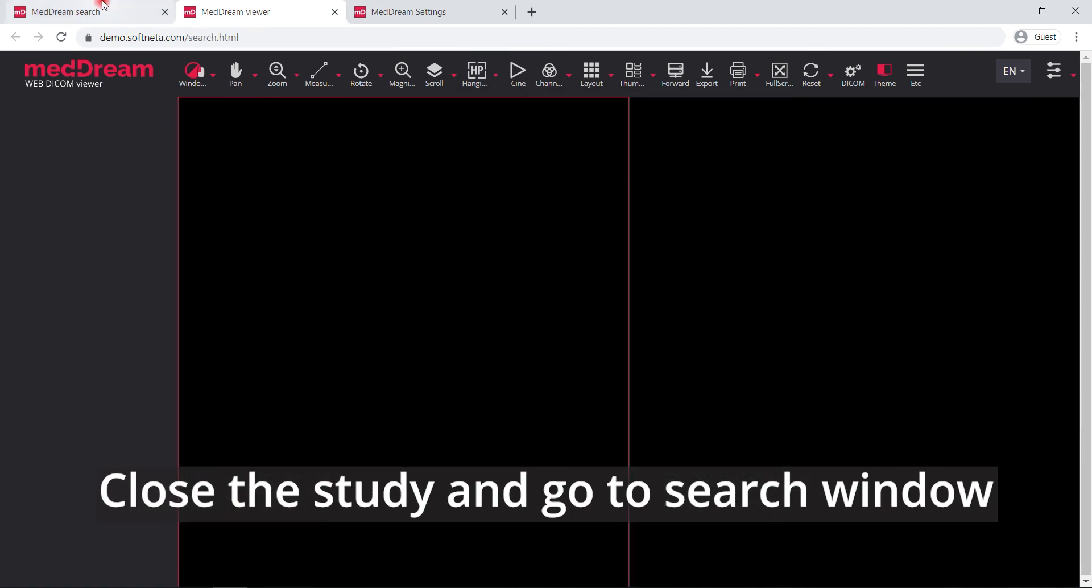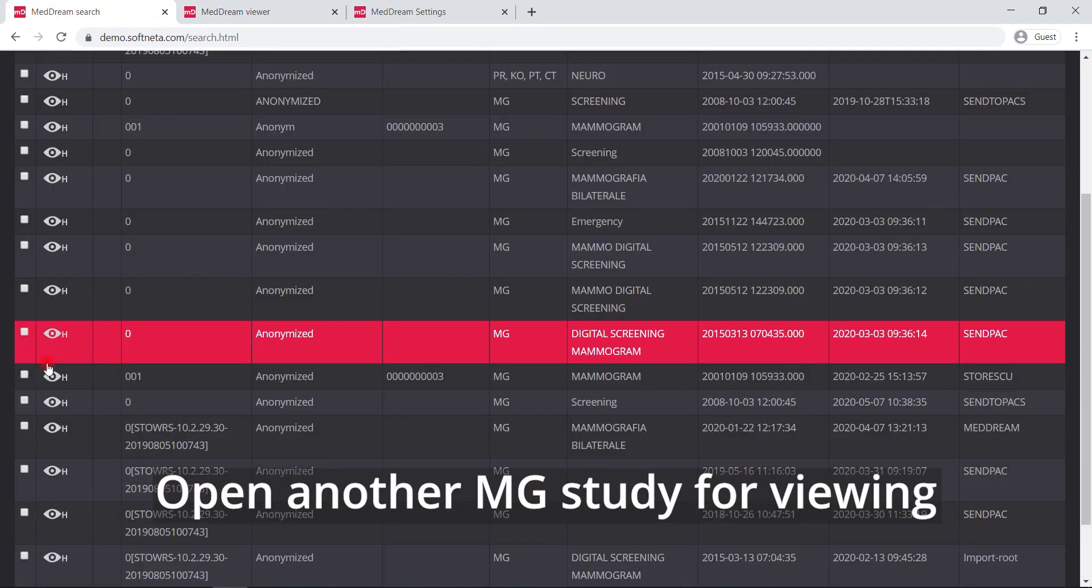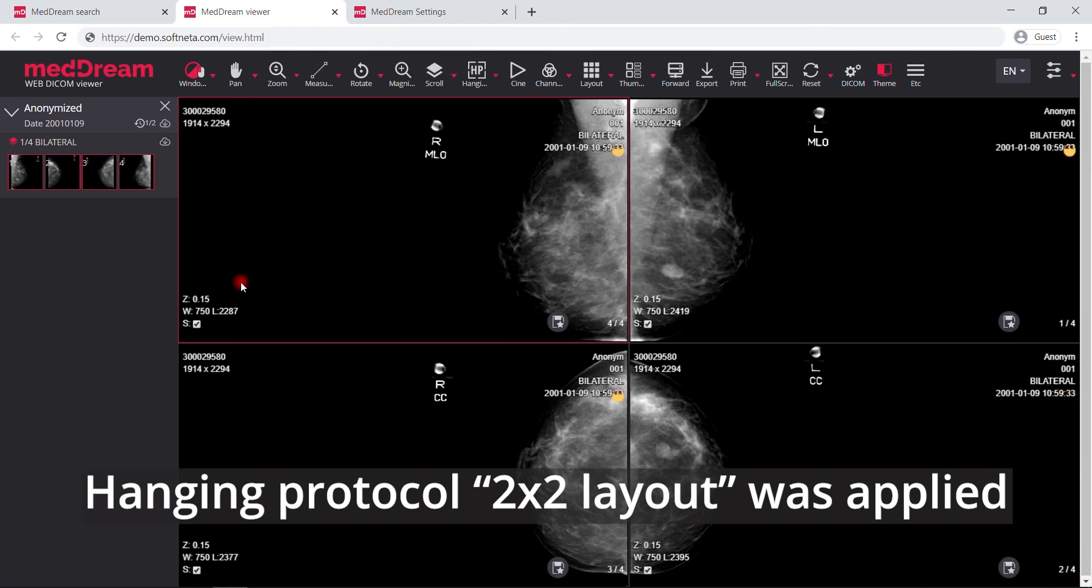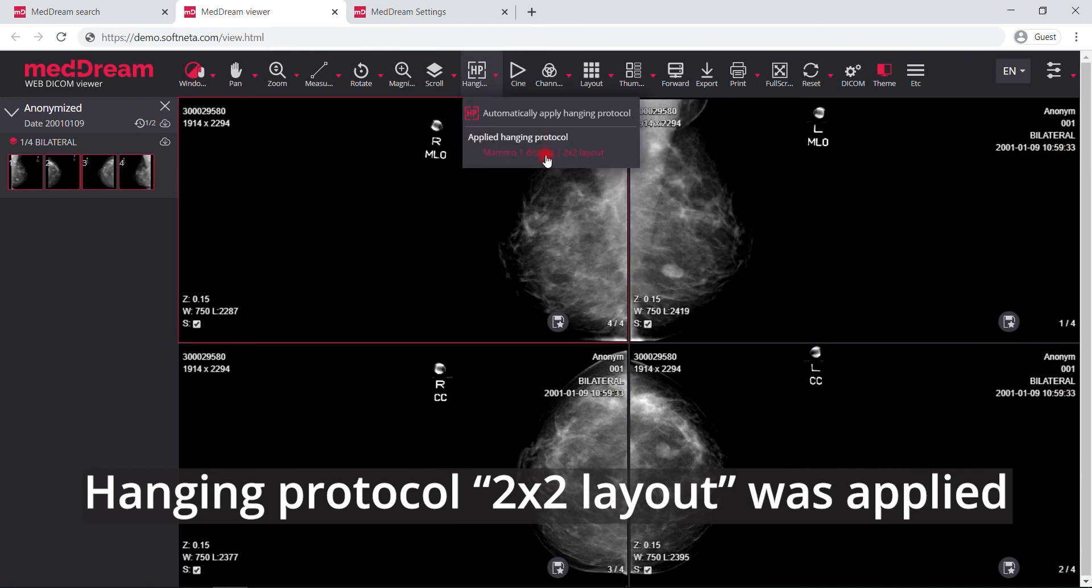Close the study and go to search window again. Open another mammography study. This time 2 by 2 layout hanging protocol was applied, because the study has four instances.